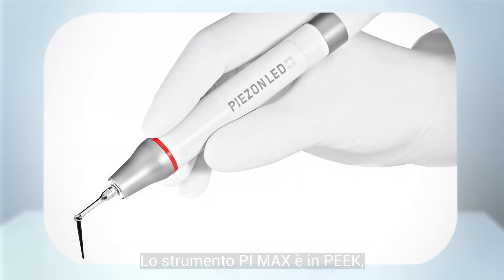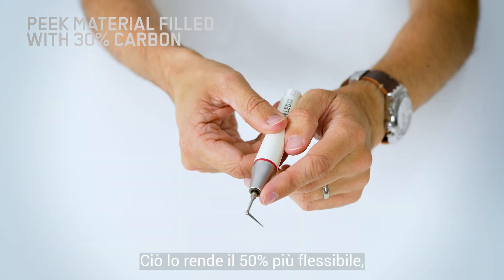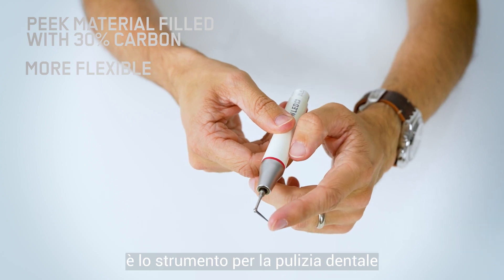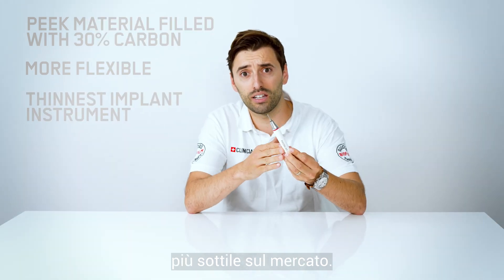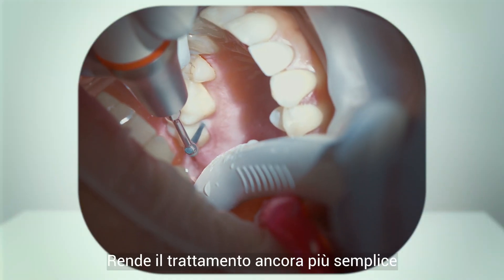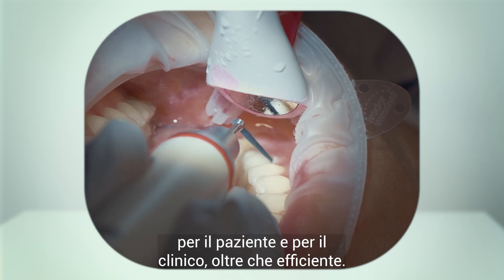This PI MAX is a PEEK material filled with 30% carbon, which makes it 50% more flexible. It is the thinnest implant instrument for power scaling in the market, making the treatment even more comfortable for the patient and for the clinician, as well as more efficient.